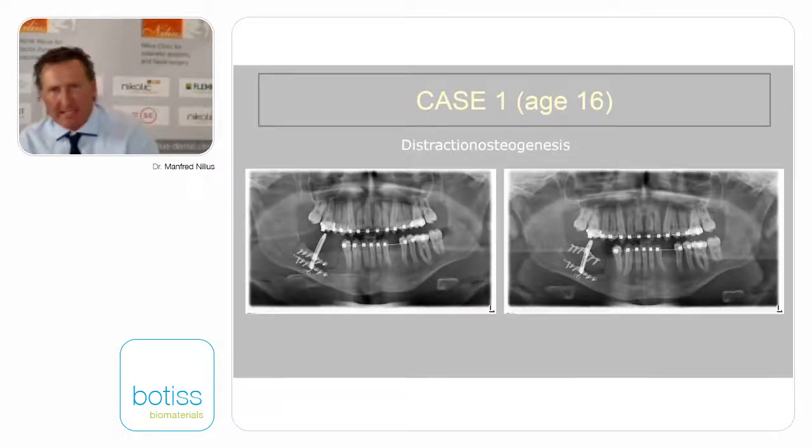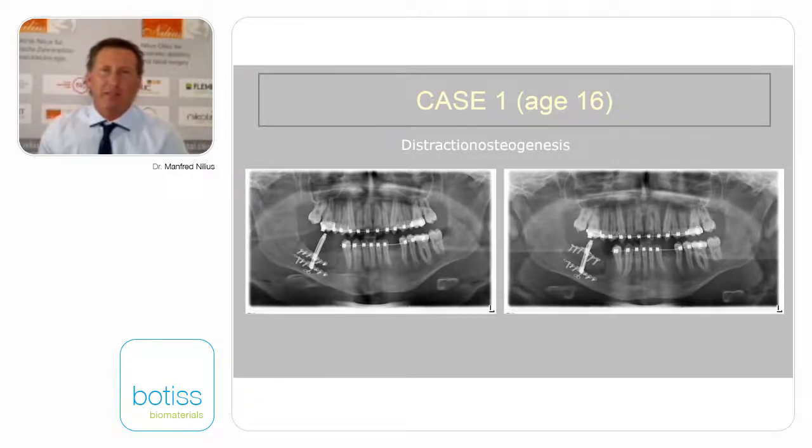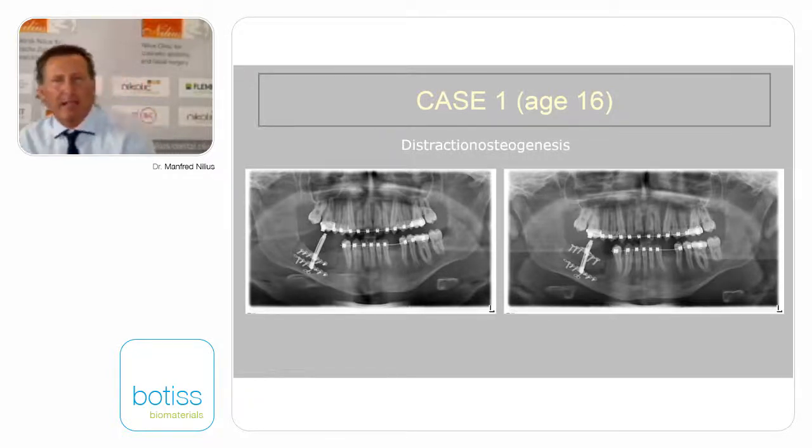After doing this, we recognized a non-growing of that bone at the age of 16. So later on, we made a distraction osteogenesis to make sure that the prosthetic height of the bone level is very good at that stage. And you can see the orthodontic treatment as well. And the lateral upper canine is in a very good condition.